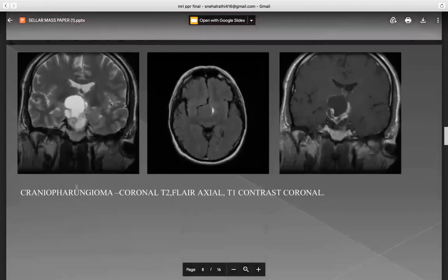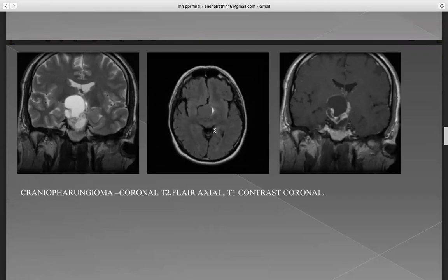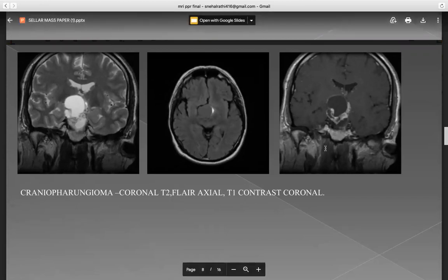These are the images of craniopharyngeoma — coronal T2 FLAIR axial and T1 contrast coronal.